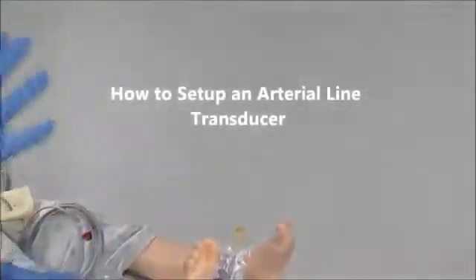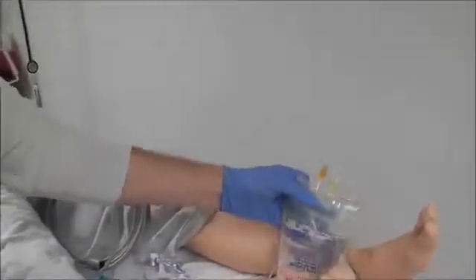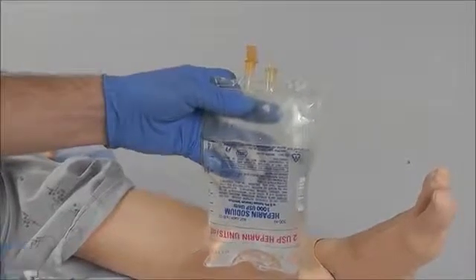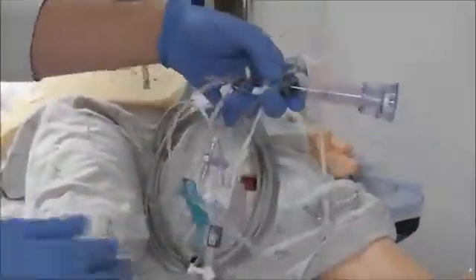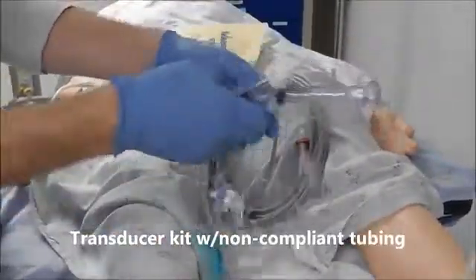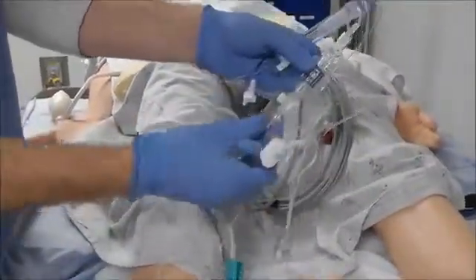We're going to need five things when we're setting up an arterial line. Number one is you're going to need a 500 cc bag of saline or heparinized saline. The next thing that you're going to need is the actual transducer that is connected to non-compliant tubing.